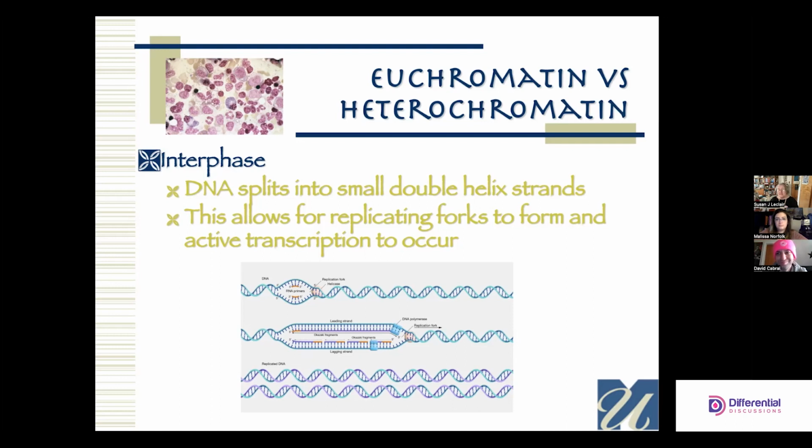It once upon a time could have been a granulocyte. It once upon a time could have been a platelet. Or worse yet, it could have been an EO or a baso or something else. Now it's going to be a red cell, and it's got this stuff.